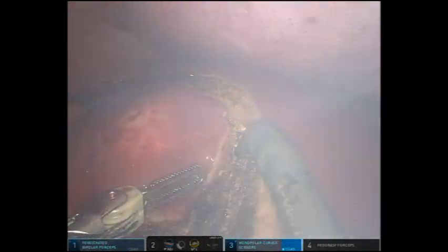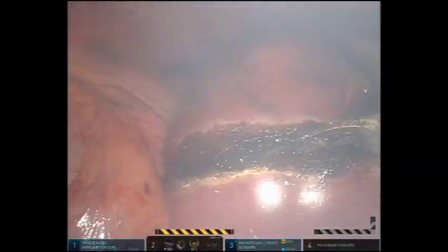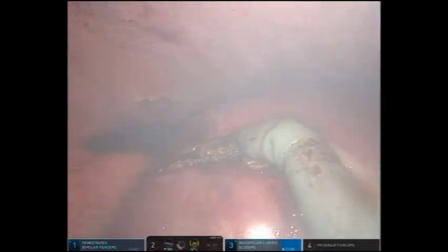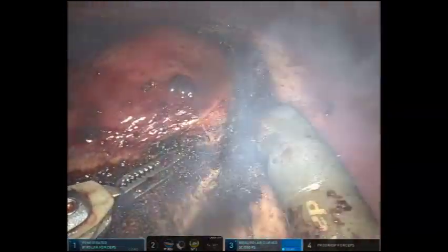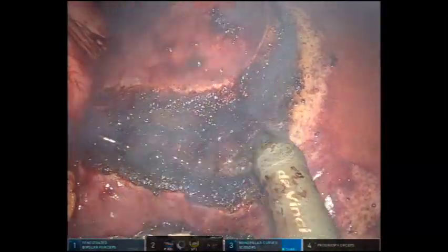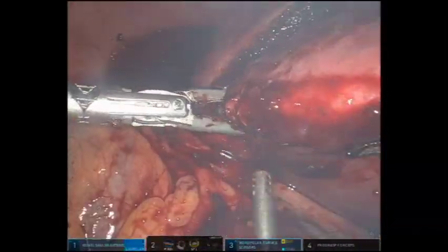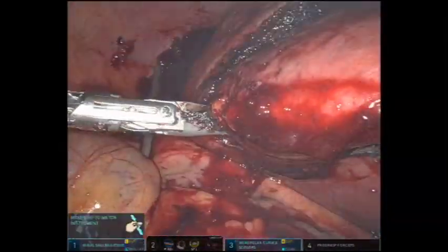As with the segment 5 resection, the robotic scissor is used to cut through the liver parenchyma and cauterize small vessels. The dissection continues circumferentially, being careful to maintain the margin.